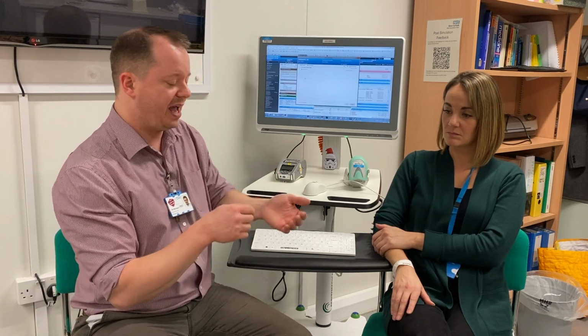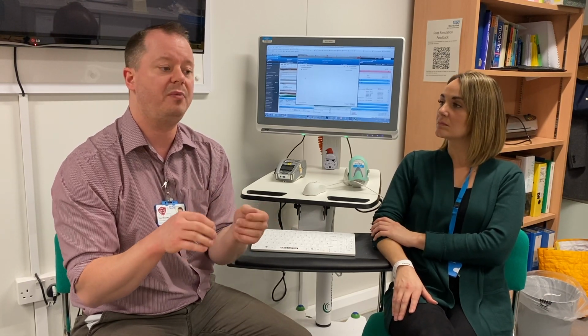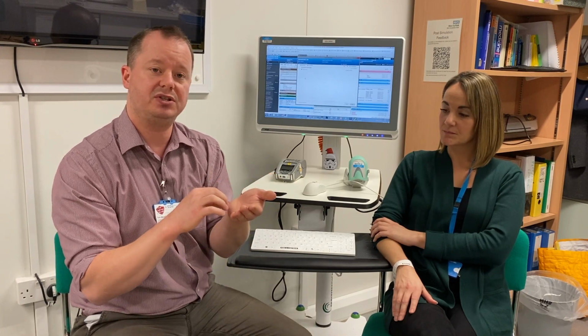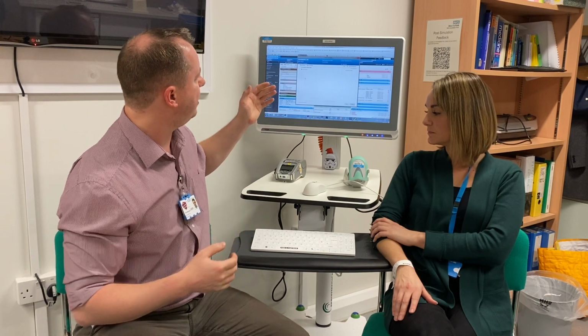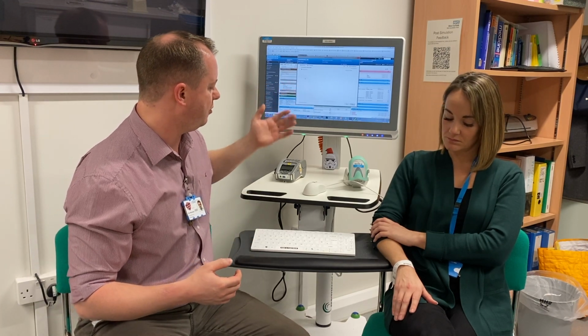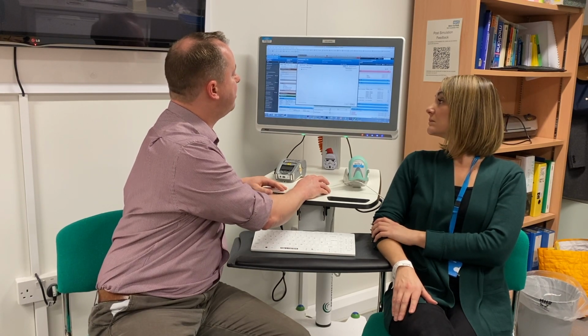So if we had a paper form, we would need to handwrite at the bedside all the patient details that were required on the form, and we would need to sign and print on the form and write the date that we took the blood sample, the same as what we would do on the actual blood sample itself. There'll be a little label in the section on that. If it's for the normal blood, so non-blood transfusion samples, we can actually print out our labels.